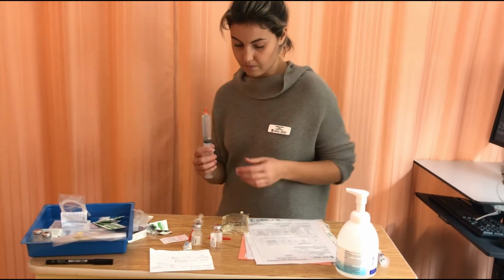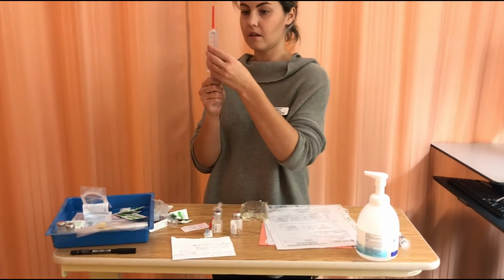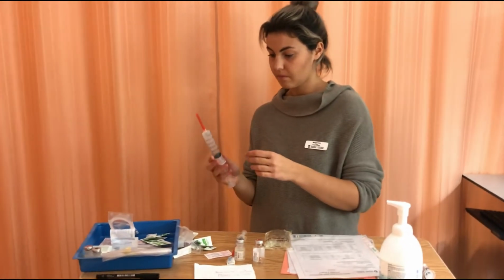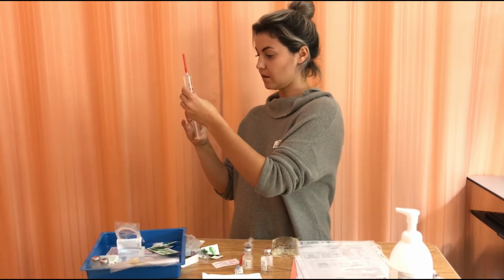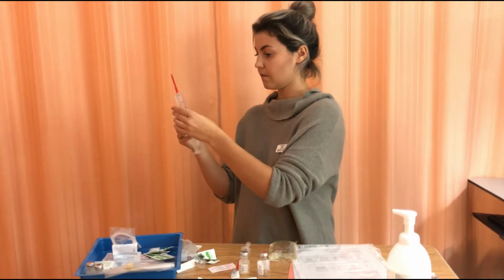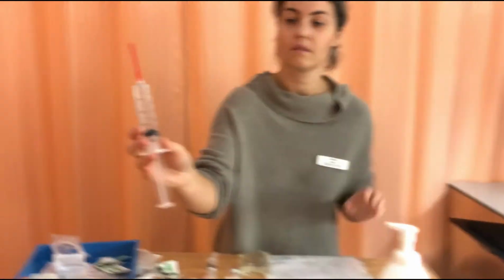Hi, my name is Denise. I'm your student nurse today. Loading my syringe here, getting rid of any bubbles in there, maintaining the sterility of the tip. So I need 10 ml. Checking your birthday and your allergies, and your IV site as well. Good, there's no redness or swelling. Draw 10 ml of air into my syringe. The drug I'm giving you today is cloxacillin. It's an antibiotic.